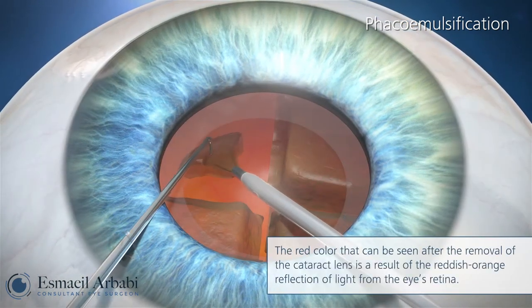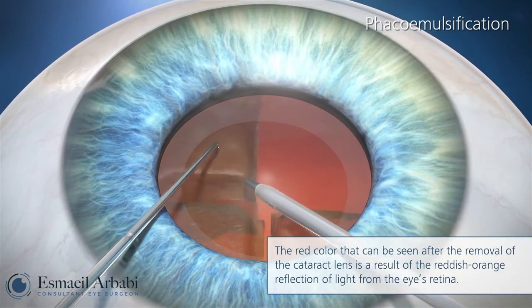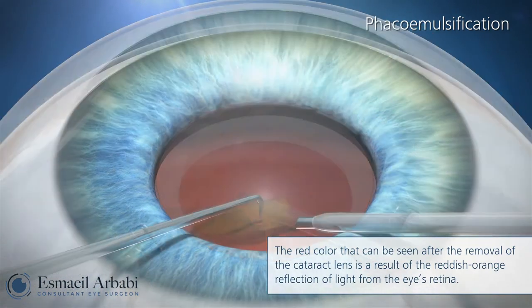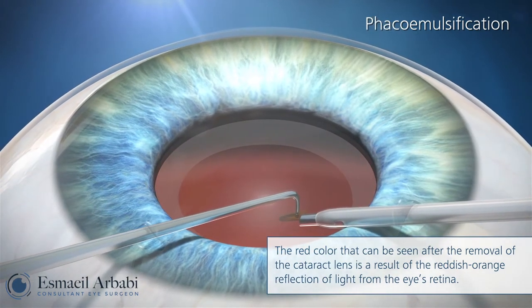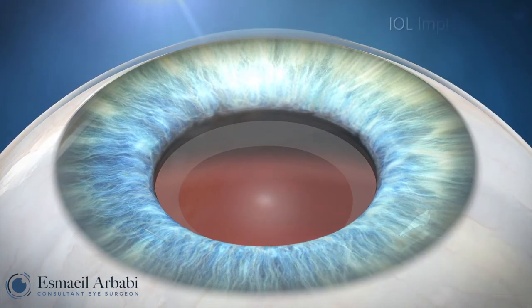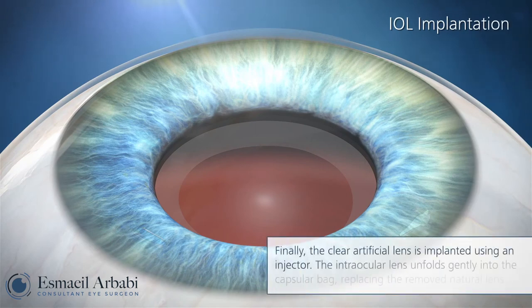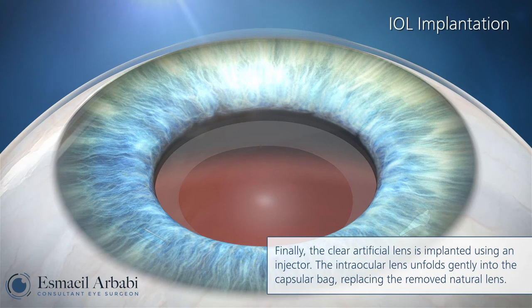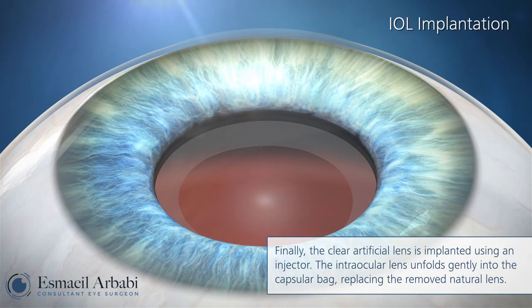The red color that can be seen after the removal of the cataract lens is a result of the reddish-orange reflection of light from the eye's retina. Finally, the clear artificial lens is implanted using an injector.